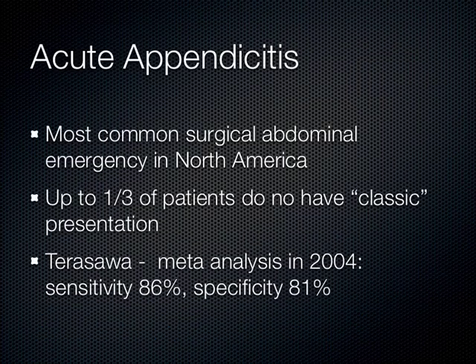Okay, switching gears, finally the appendix. And acute appendicitis is very, very common, okay? It's the most common surgical abdominal emergency in North America.